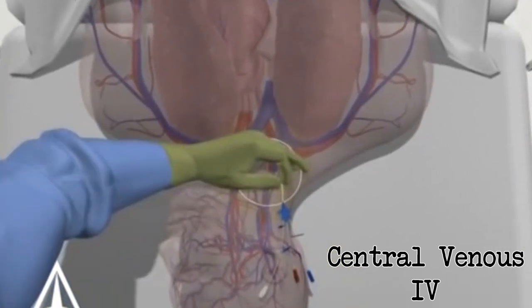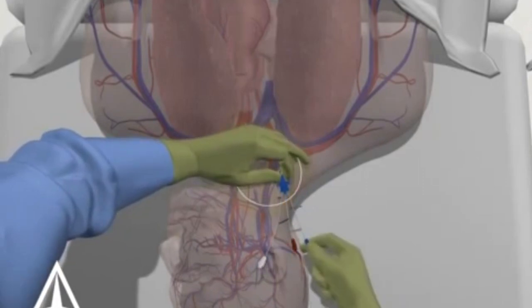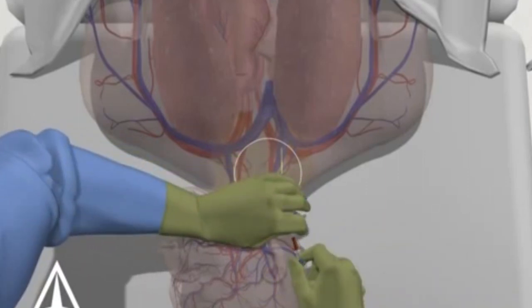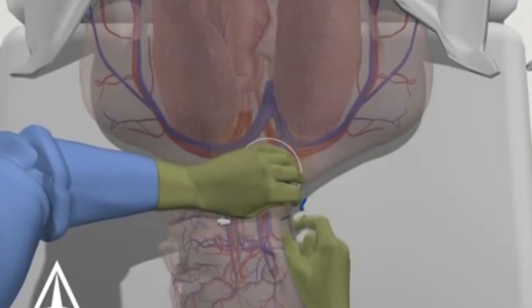Central venous catheter. Central venous catheters are those that are inserted by a physician through the vein in the neck, upper chest or anterior chest, with the tip in the vena cava of the heart. There are actually four types of central catheters. One is the PICC, while the others include a non-tunneled external catheter, a tunneled external catheter, or an implanted port. The latter two catheters are surgically placed.